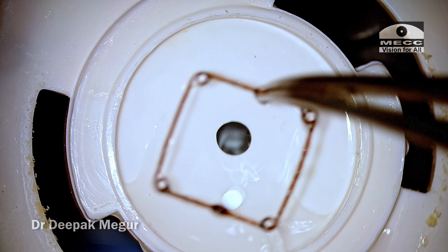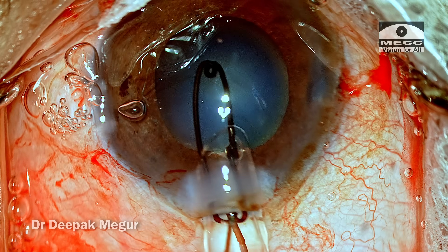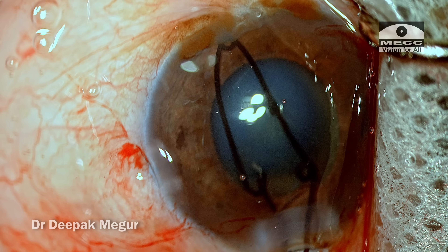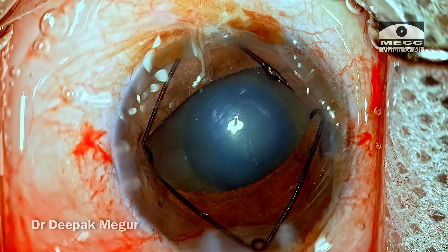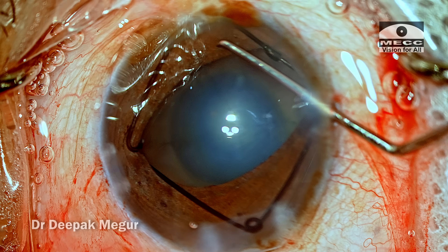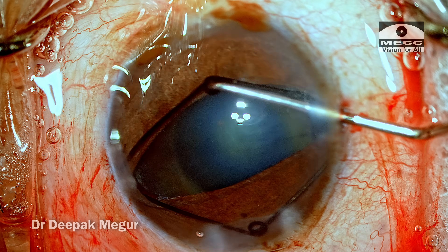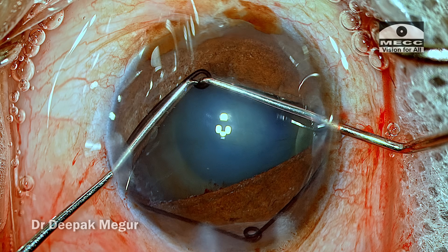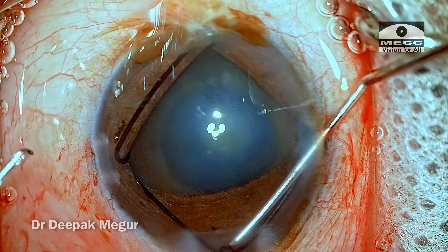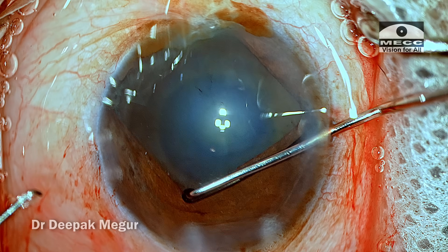Time to place the pupil expansion device. This is the Gupta dilating ring and under the cover of OVD, it is placed into the anterior chamber. While inserting, the two side hooks are engaged onto the pupillary margin itself, and now I need to engage the two notches on either side to the pupillary margin. Using a Sinskey hook, the ring is retracted down and then the notch is engaged. The same thing is done on the last notch. Now we have an excellent view of the cataract.